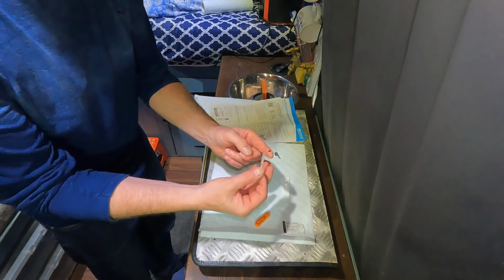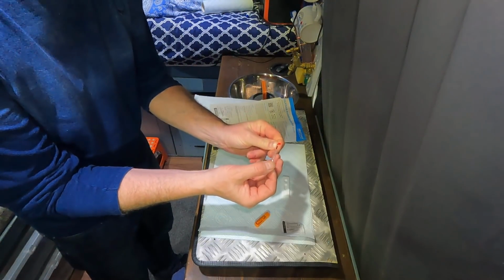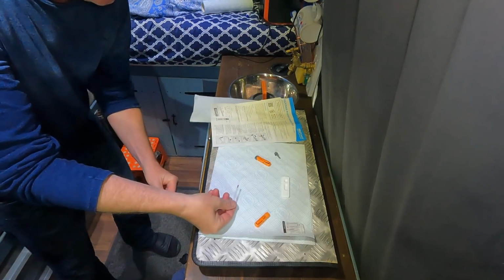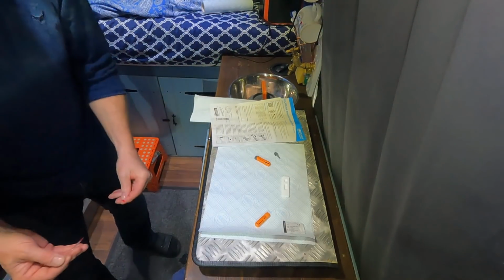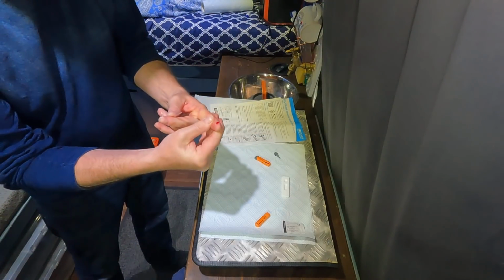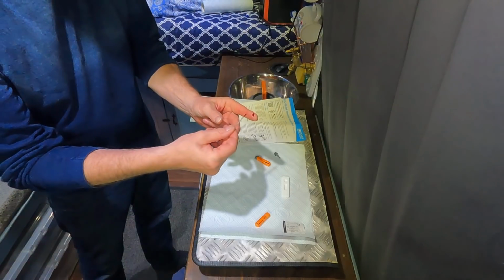Now it's just to hold this next to it and the blood should go inside. And it does as well. Oh, need loads more than that. Oh crap. Just not in there enough. I can't get my blood to go in there. Oh, there we go. Haha. Massage it. There we go.